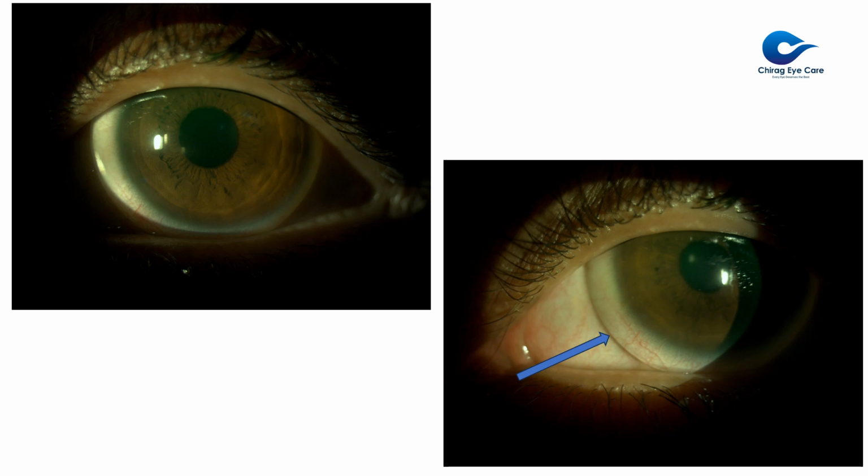The patient came in for dispensing, and this is what the lens looked like on the eye. So these are taken with my slit lamp. So I would just like to point out the edge of the scleral lens here. As you can see, this is the edge of the scleral lens. Take a close look at the blood vessels here. The blood vessels look normal. If this area appears white or you notice blanching of the limbal blood vessels, then the lens is too tight. You need to adjust the parameters accordingly. Since the vessels are seen normally here, it is suggested that the fitting is good.